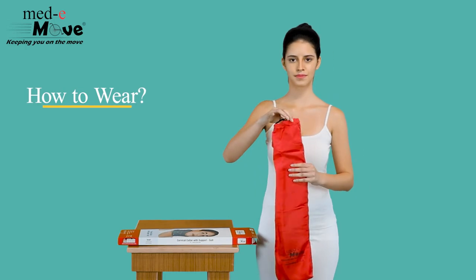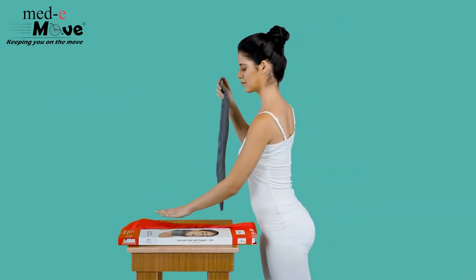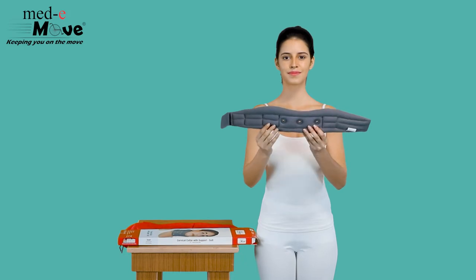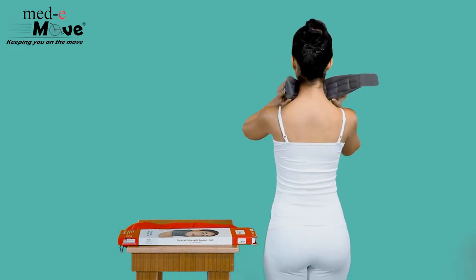Now let us see how to wear the Medimove soft collar with support. Ensure the collar is worn firmly and comfortably around the neck. Make sure the curve is placed under the chin and fasten the hook and loop closures at the back. The collar must be positioned in the center, supporting the chin and the cervical bone.